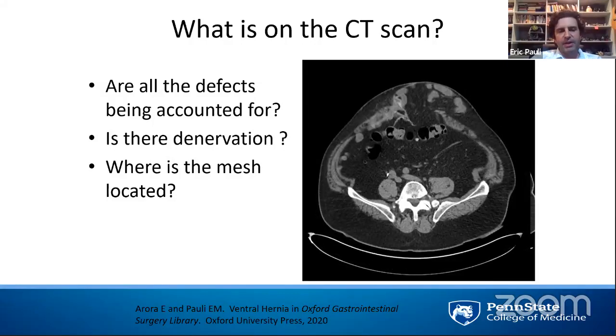Finally, we're going to spend some time talking about mesh. Understanding where mesh is located, the planes that were violated, and what is adjacent to the mesh is, to me, a very big determining factor in what operation I'm going to offer the patient for their recurrent hernia surgery.